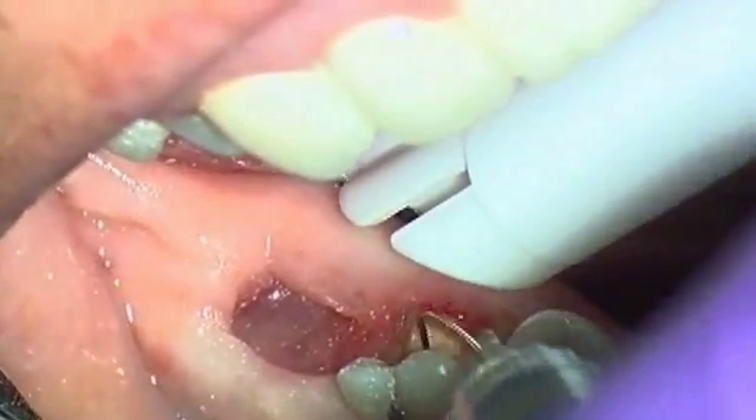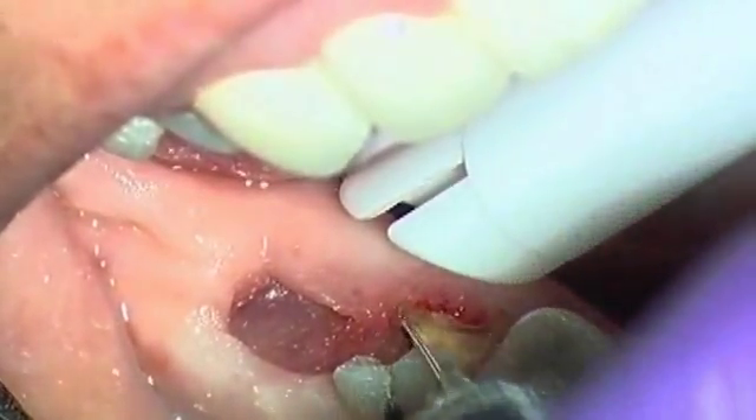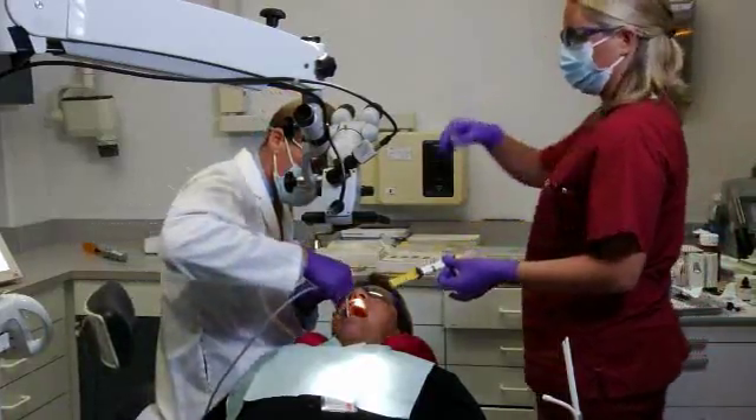Disinfect the post with alcohol and dry it. Clean and disinfect the root canal with sodium hypochlorite solution. Rinse immediately with water and dry with paper points.